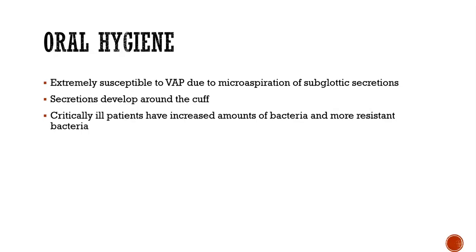Okay, so with these patients, when they are intubated, we always want to make sure that we are doing our due diligence with providing really good oral care. Most of the time it's every 2 hours. I know both hospitals here in town, NEA and St. B, require every 2 hours. It's usually a little oral care kit. They're disposable, but it hangs on the vent or on the wall beside the vent, somewhere in the room with the patient, because they are extremely susceptible to developing ventilator-acquired pneumonia, or VAP.